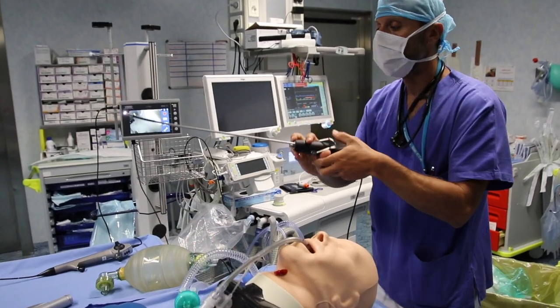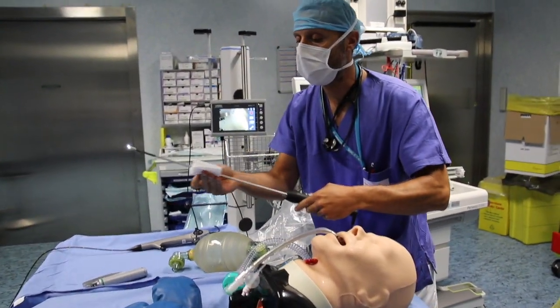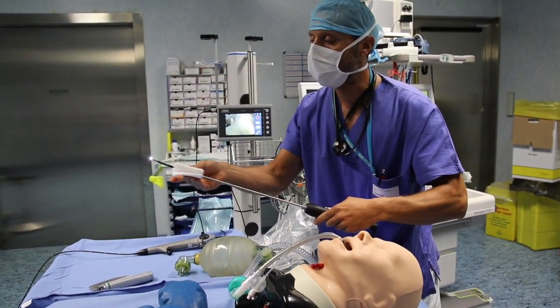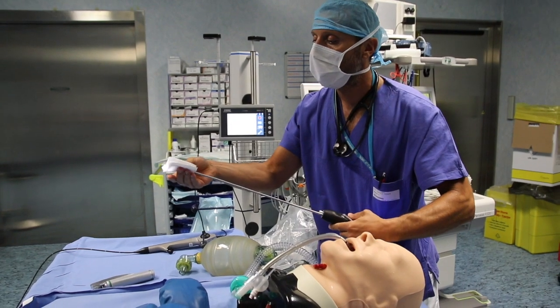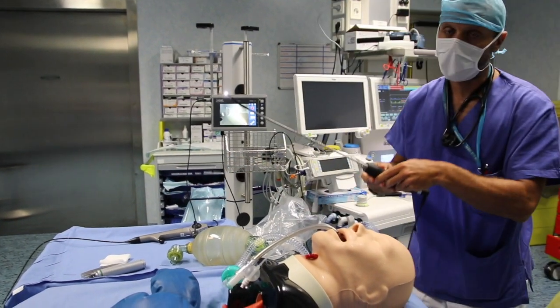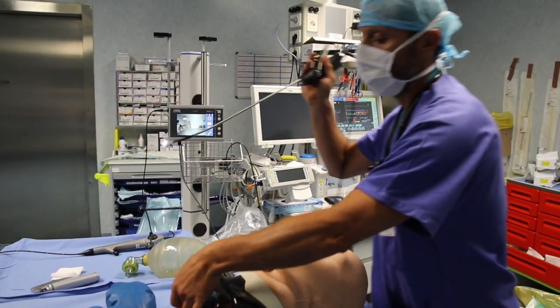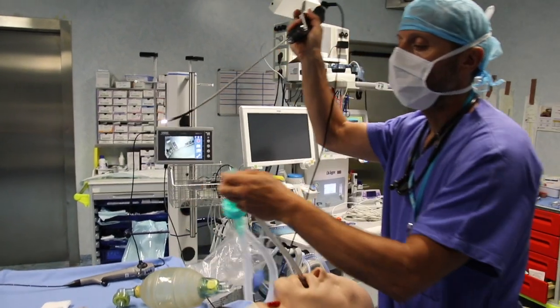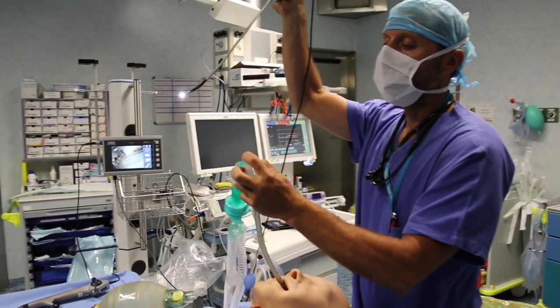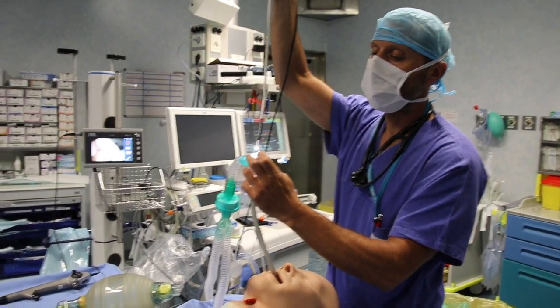First, don't forget to lubricate the instrument so that it may slide easily inside the tube. Next, introduce it through the T-mount.